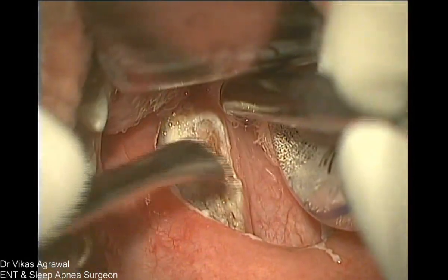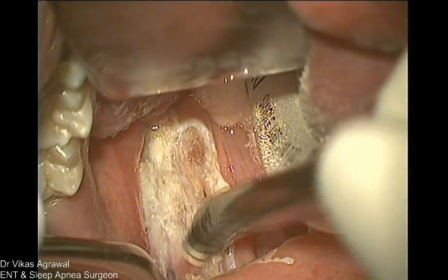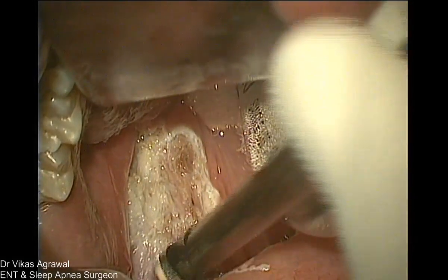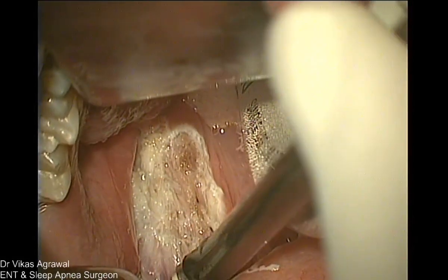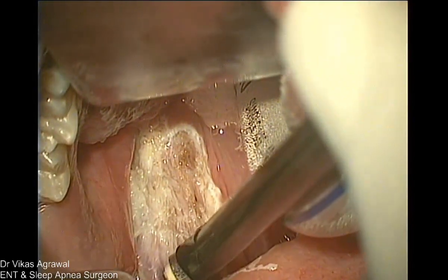Now we know that this part was the reason for lateral collapse, correct? Right. Okay, can you see the paratonsillar vein? Yeah, seen very well. Huge one, right? Yeah, big one. Big paratonsillar vein. Is it seen very, very clearly? Yeah, seen very well. We have got good audio visual, Dr. Vikas.